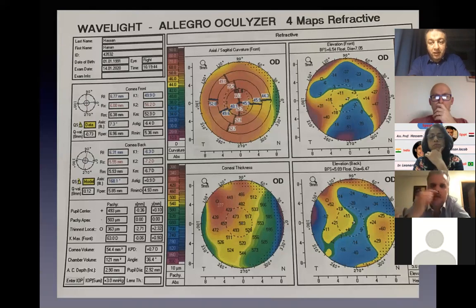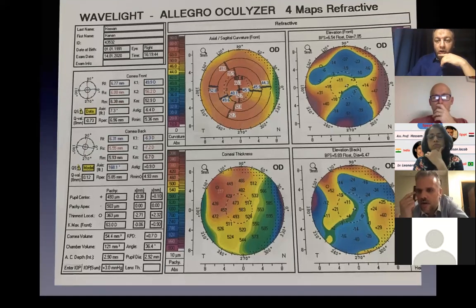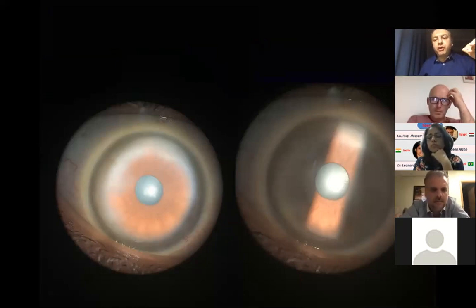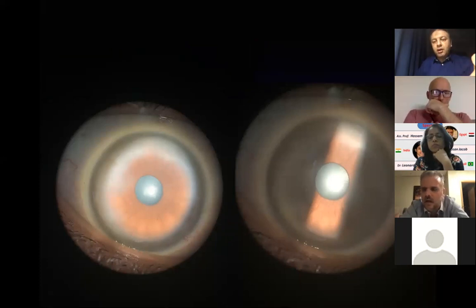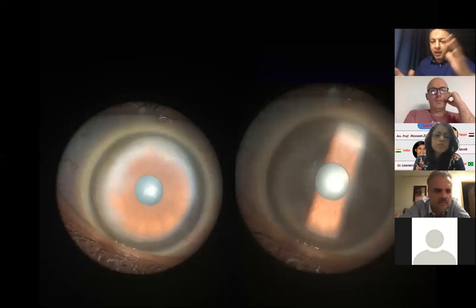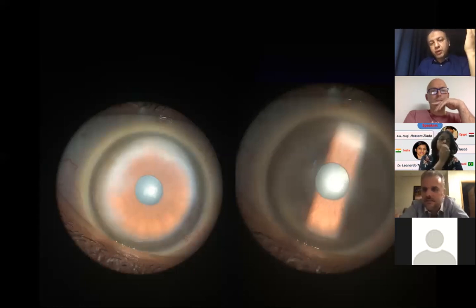Is there any neovascularization in the cornea? Look again at the limbus. Look again at this picture. There is a whitish shadow around it, like that of arcus senilis, but it extends from the periphery of the cornea toward the center, occupying all the peripheral and mid-peripheral parts of the cornea. So the thinning is here, and she is not traumatic. Is it like Terrien's or something? I thought of Terrien's marginal degeneration, but there is no history of vascularization or redness or inflammation. I cannot trust the patient's history all the time, but we have to respect it until proved otherwise.